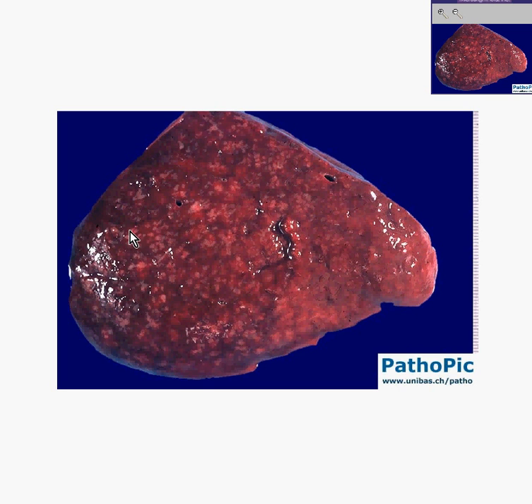And not only are there a lot of white pulp areas, but some of them are very big. So you might suspect that this spleen should have more lymphoid tissue in it than it should. And this is really a terrific way of telling if, for example, a spleen is involved with lymphoma or leukemia or other hematologic malignancy, like they often are. Let's take a look at the peripheral smear on this patient.